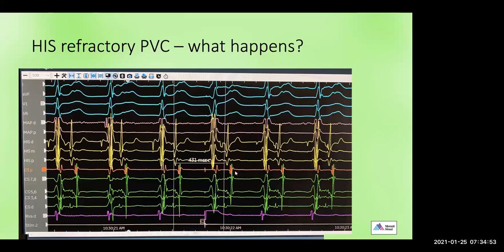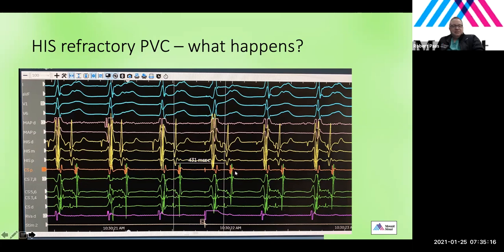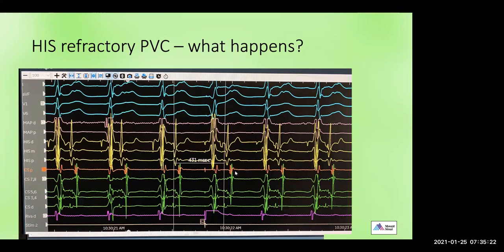So I guess we already did a transseptal, so we're already in the left atrium. And this is the third time. You don't want to leave anything behind, so you might as well do both the ablation of the left-sided accessory pathway, and then come back and try to map and ablate the AVNRT. Well, see, having been around you long enough has very strong influence on us.